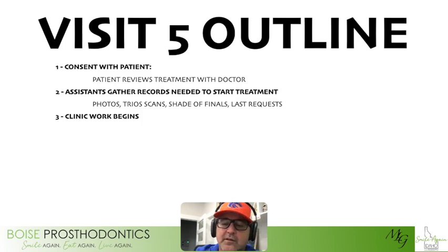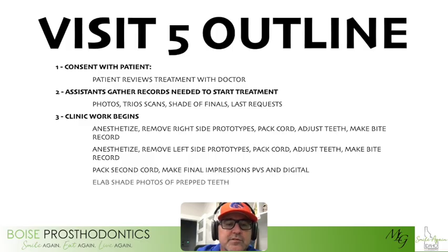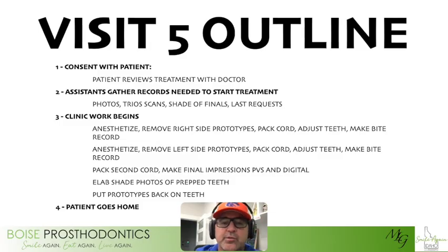Otherwise, the lab cannot make us something that fits the teeth properly. And so I really, really focus on that. So there's the basic steps to do that and getting the lab the records they need. Then we put their existing prototypes back in and they go home. Then I'll write a very detailed lab prescription and get everything to them and spend some time talking to them in person to make sure that we get the outcome that we want.